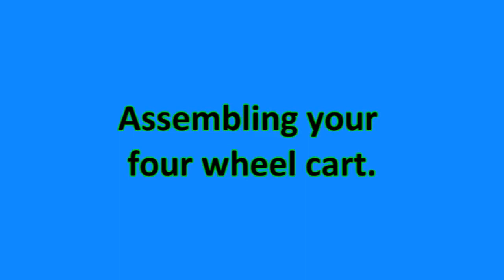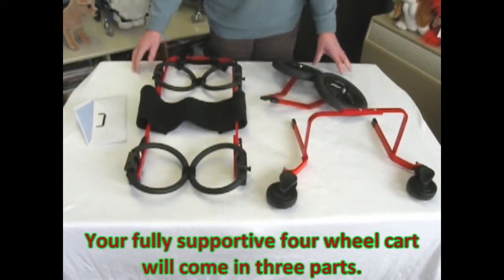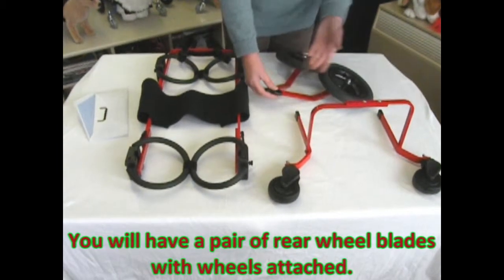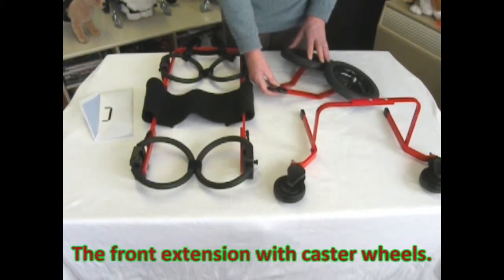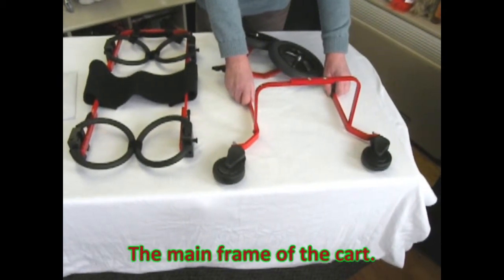Today we'll be assembling your four-wheel cart. Your fully supportive four-wheel cart will come in three parts: a pair of rear wheel blades with wheels attached, the front extension with caster wheels, and the main frame of the cart.